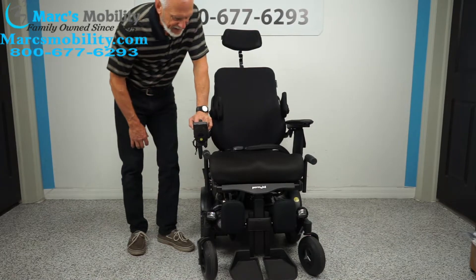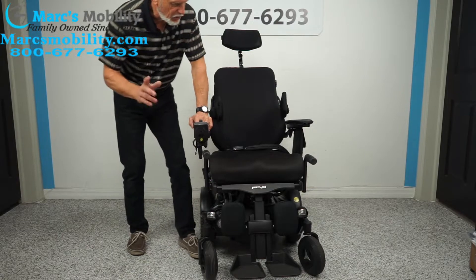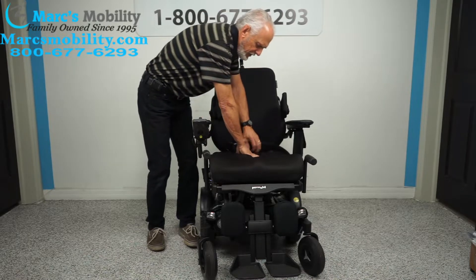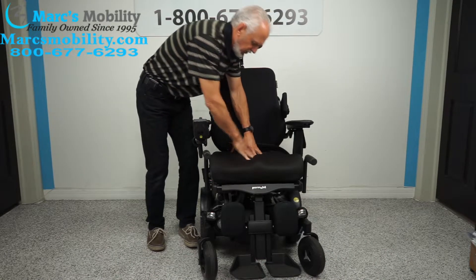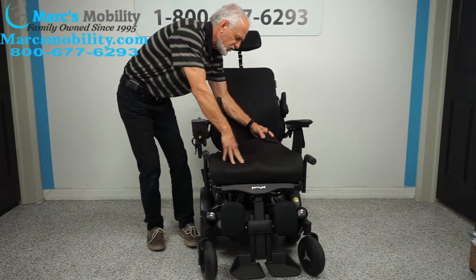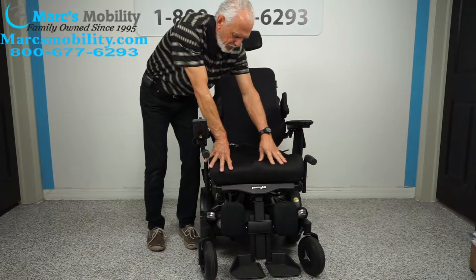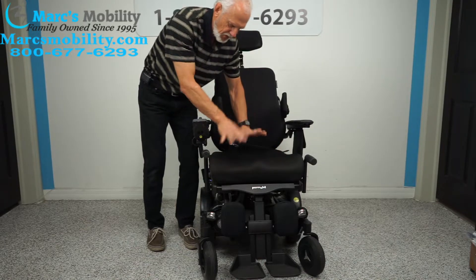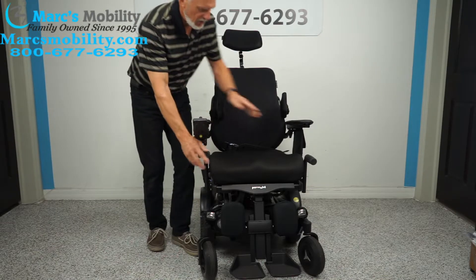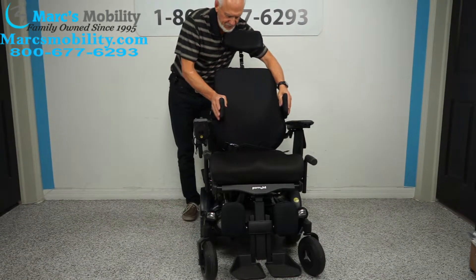The cushion right now is 20 by 20. This is foam with air bubbles — you can put air in this cushion with a little plastic pump. There's a valve in the back and you just hook up a pump. This is a foam-contoured, really nice cushion. You have flip-up arms and a swing-away joystick as mentioned, plus push bars.